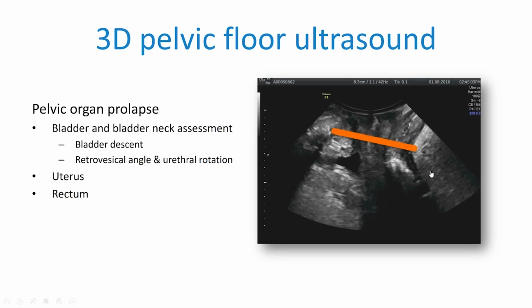Just to show you here, this is our pelvic floor, again running from the pubic bone and around the back of the bowel.